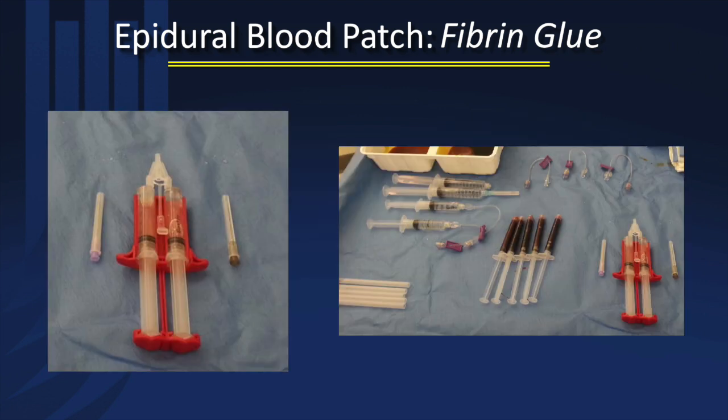This is what it comes in. It's got two different syringes and a Y connector where it enters and mixes inside the patient. That's usually how we do it. And this is our setup here.